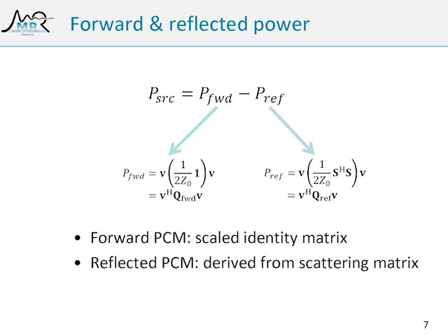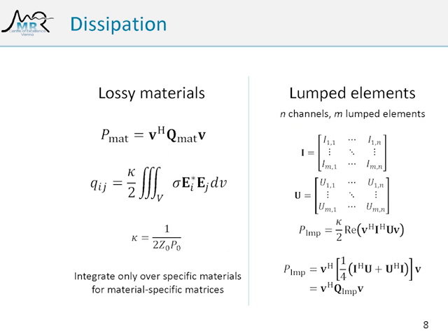At the bottom should be P source, the source power. What really goes into the coil is basically just the forward power, that's the power coming from the amplifier, minus the power that goes back from the coil array due to reflection or coupling. The whole point is using the field data.